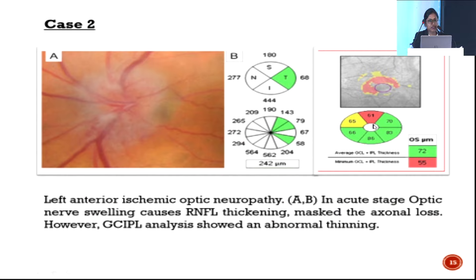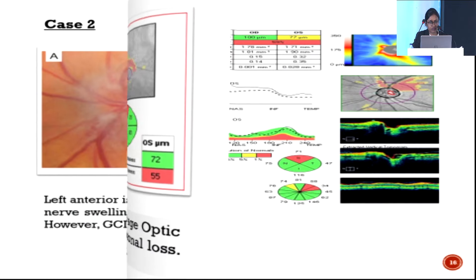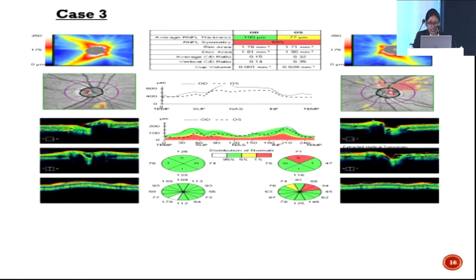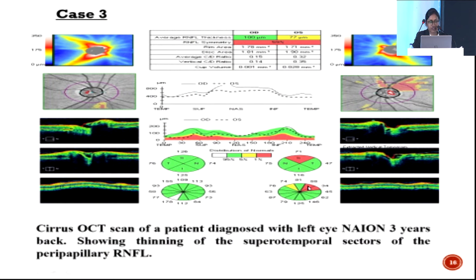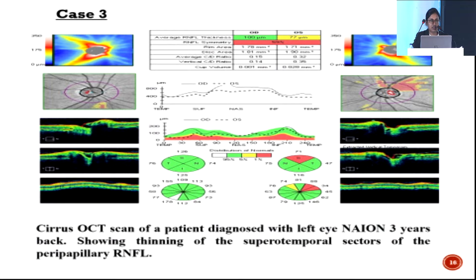However, ganglion cell to inner plexiform layer analysis shows abnormal thinning, indicating axonal loss. In a patient diagnosed with left eye non-arteritic ischemic optic neuropathy three years prior, thinning of the superior and supratemporal quadrants was noted. OCT also helps differentiate acute from chronic ischemic optic neuropathy: in chronic cases there is loss of both RNFL and ganglion cell layer, whereas in acute cases RNFL is thickened but ganglion cell layer is decreased.